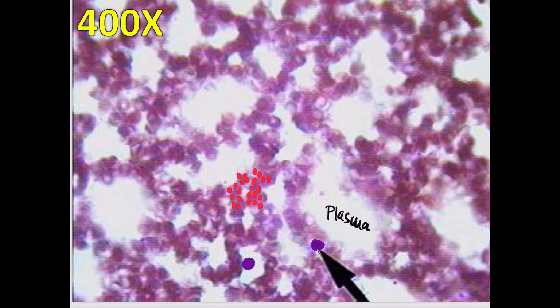And then we're going to have white blood cells. White blood cells have a lot of protein in their outer coating. And so they dye really, really deep purple when they're dyed. And then the rest that you're seeing here are the red blood cells, which are significantly smaller. So white blood cells are big and fluffy and have a really thick, remember, coating on the outside of them. And then the red blood cells are much smaller. So I do want you to know the scientific names of these, which were in the cells unit. So I'm just going to remind you of those when we're labeling that on the back. So that's why we color coordinated it.